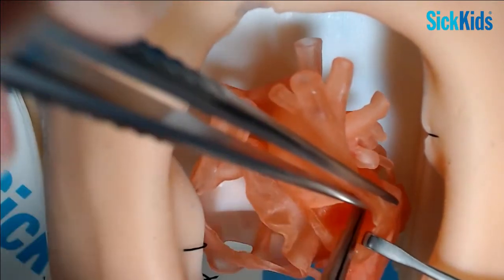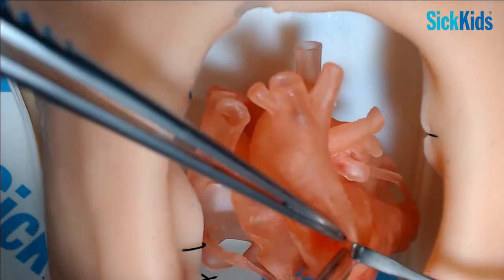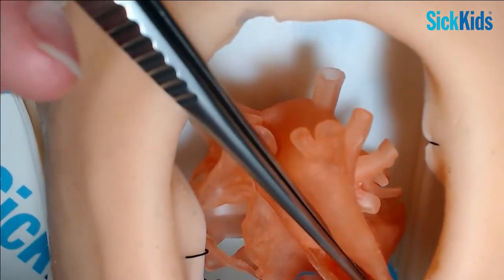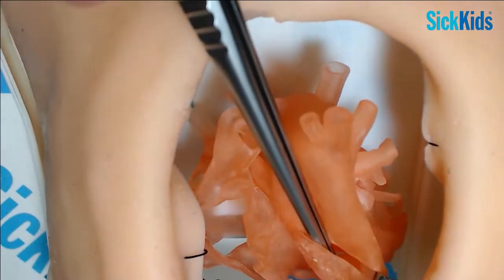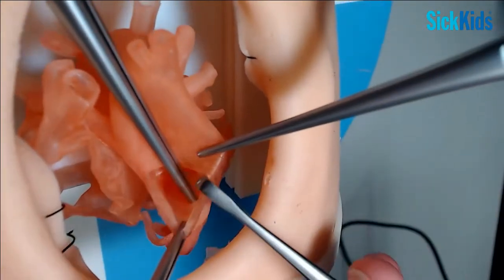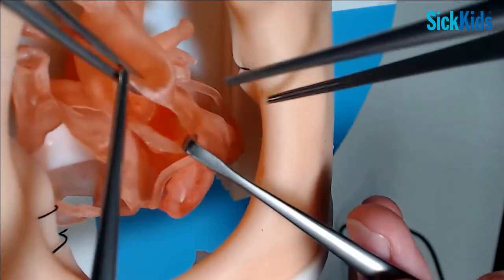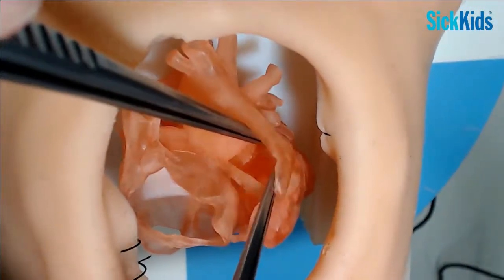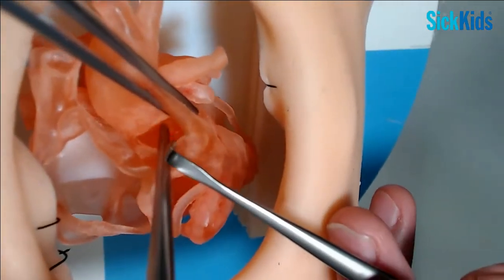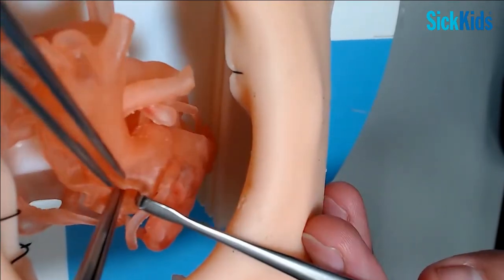So you can see the valve down there, which looks good, and hopefully I can see coronary ostia down there. Can you see that on your TV screen? You can't. Do you want to move your camera? There we go. But you want to take your time and prove to yourself you can see where the coronary ostia are. They may only have a single coronary, and they may have coronary ostia that are right up against the top of the commissures sometimes, and before you know it, you're in them if you haven't checked where they are first.